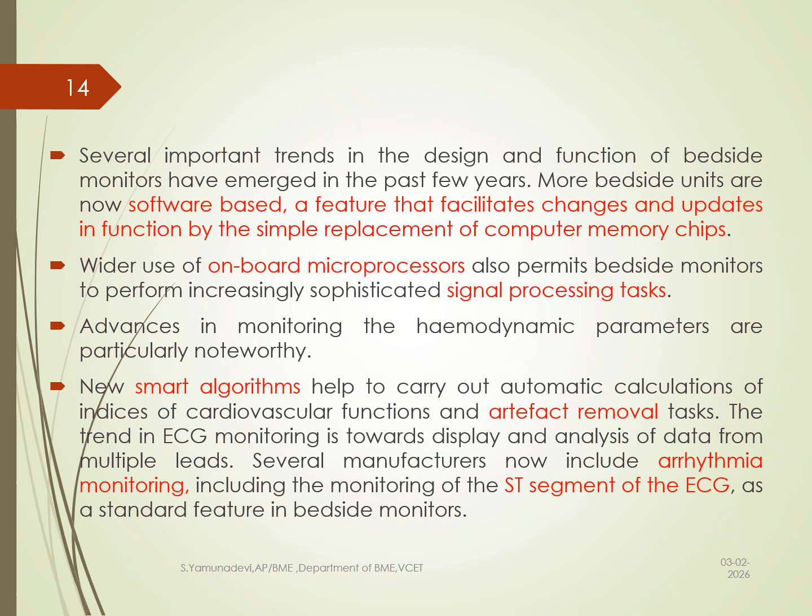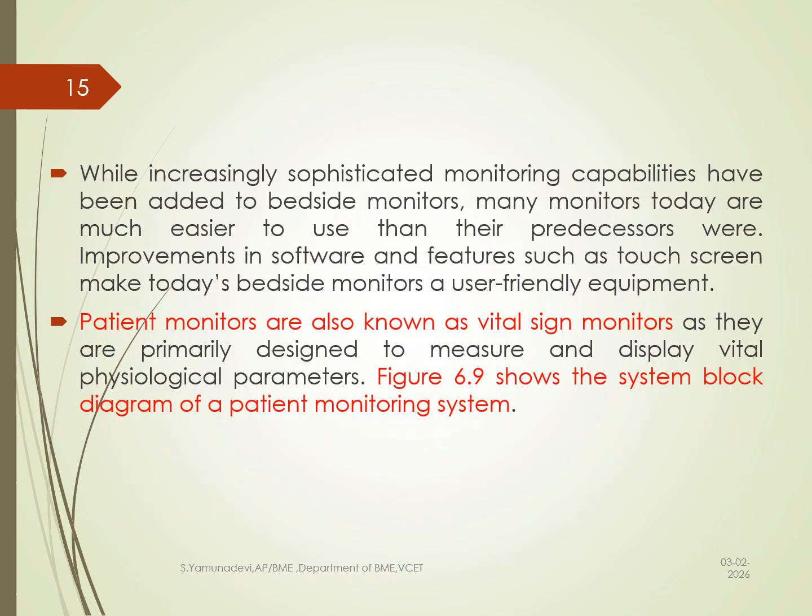If any is detected, it is removed by using those algorithms. They also have ST segment elevation in the ECG, and that is also considered as an arrhythmia in this arrhythmia monitoring unit. The patient monitor is also known as a vital sign monitor.